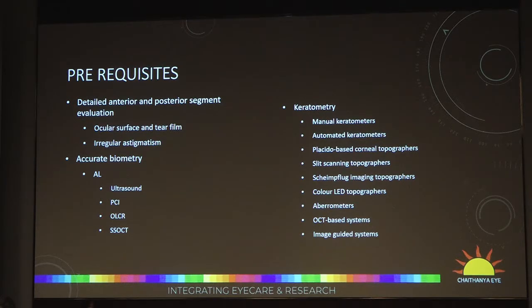The ocular surface and the tear film are of paramount importance. And I would always suggest, if you have access to a topographer, even a placido disc-based topographer, to do a topography before you plan on a toric IOL, rather than just keratometry. Because the topographer gives you a better idea about irregular astigmatism, and it does not just tell you about meridians. And when you have irregular astigmatism, your planning kind of changes. That I'll explain later. And of course, axial length has to be accurately measured, preferably with an optical biometer.